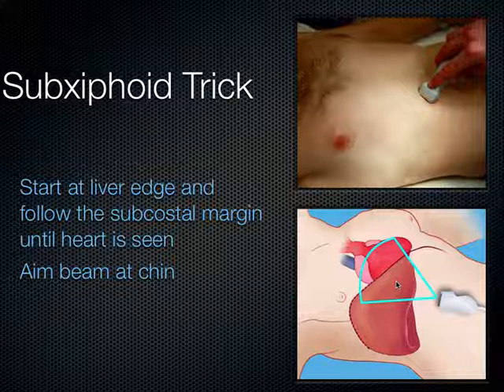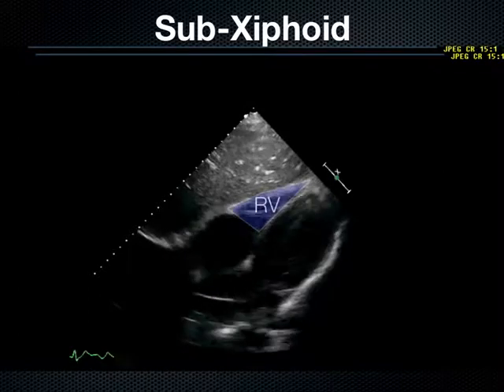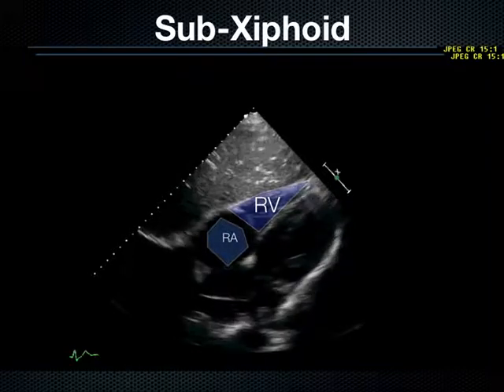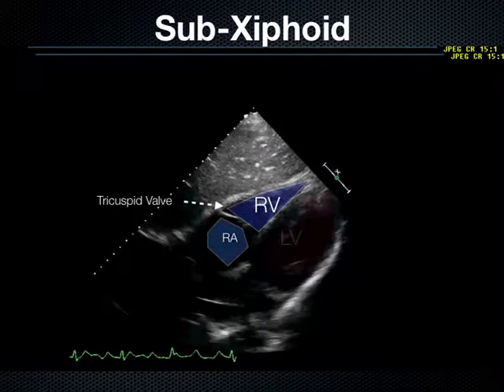That's the idea. And as you do so, it's difficult to do this when the patient's got a small liver, because you don't get a very good window then of this heart. And so if you have a patient who's got cirrhosis of the liver, this can be quite a challenging view to get. And so just keep that in mind.